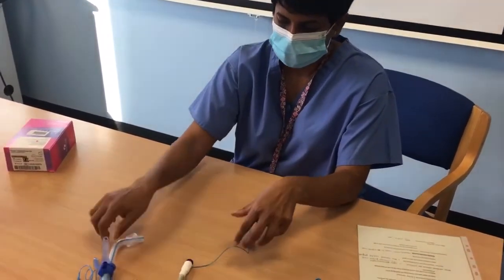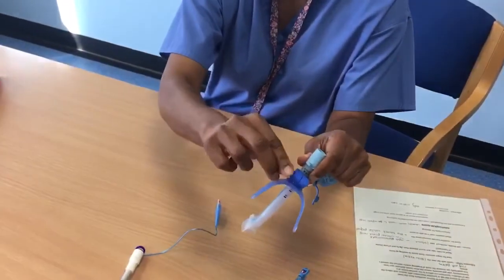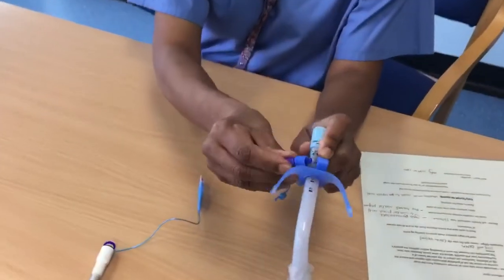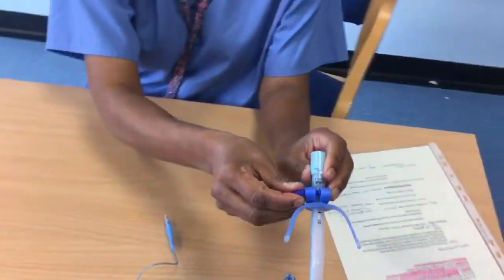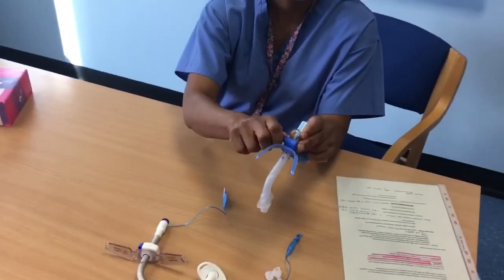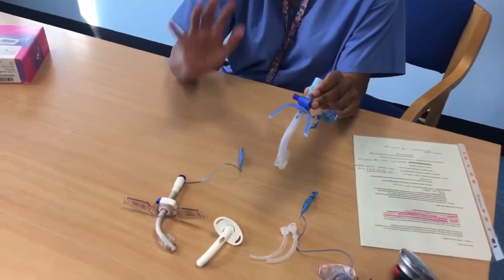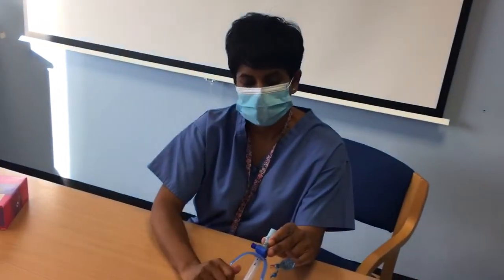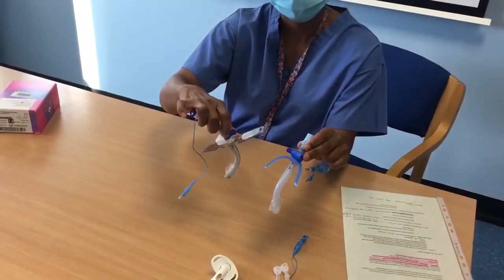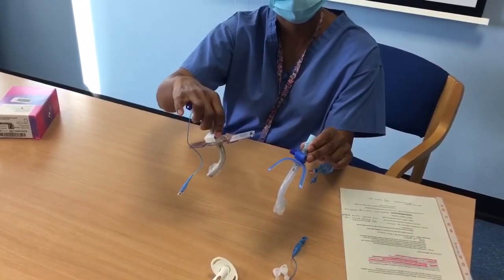The other version that we have is where we secure the length of our tracheostomy tube. This one's a screw version, as you can see. So it takes a bit of doing to undo that. So you can probably see some of the safety issues that may crop up with your patient. The latch seemed a bit easy to move, so again, part of our safety checks is to make sure that latch is in the correct place.